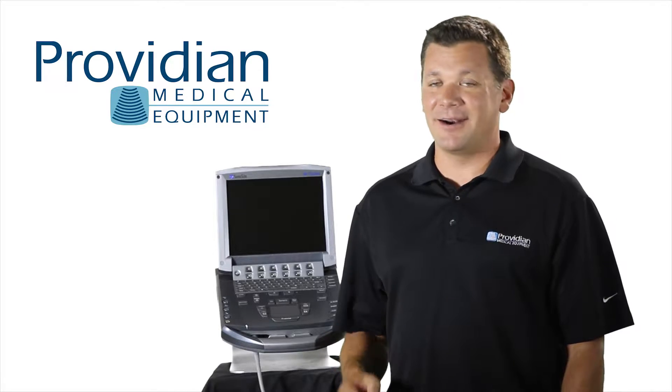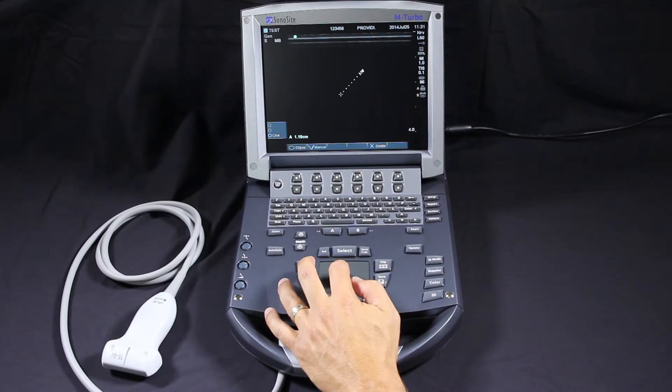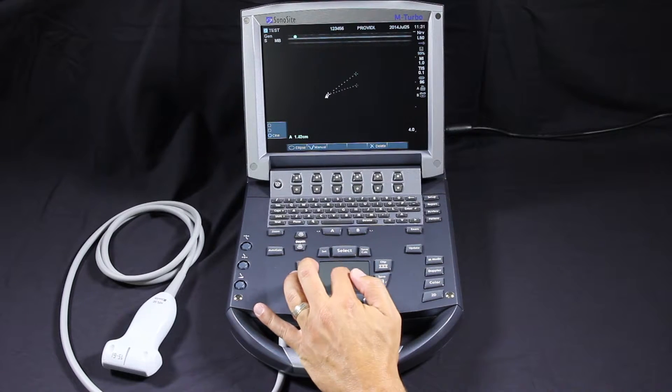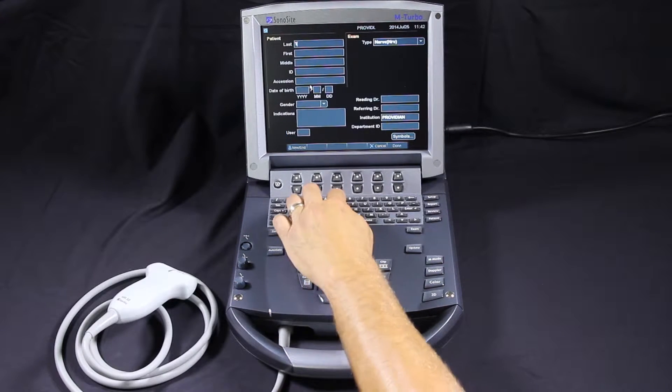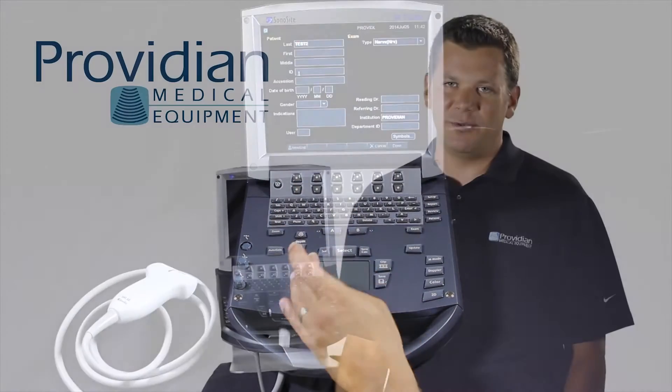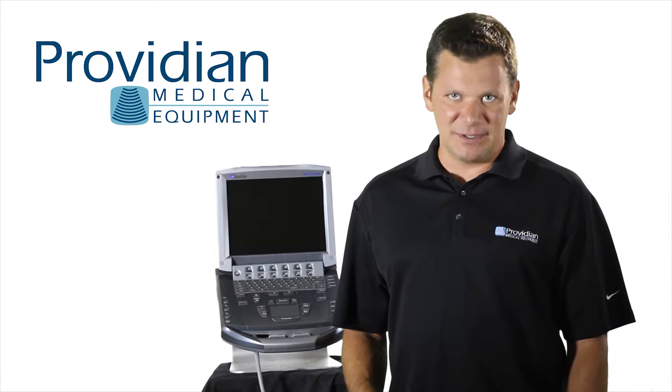It's a small system, small monitor, small user interface. The trackpad isn't really conducive to a situation where a lot of measurements are taken. You can't make custom imaging presets, this keyboard is small, it's limited image optimization, and there aren't many bells and whistles. It's designed for its simplicity.